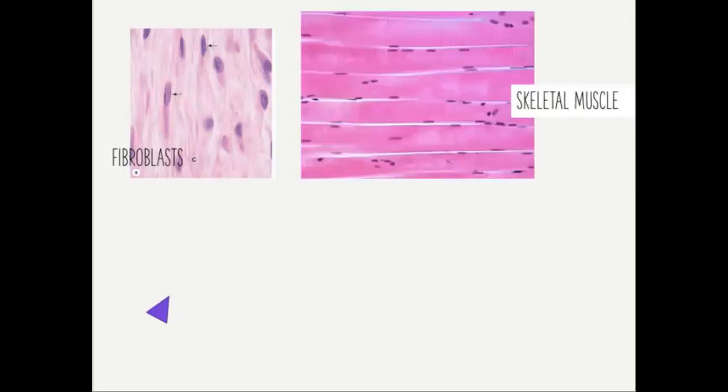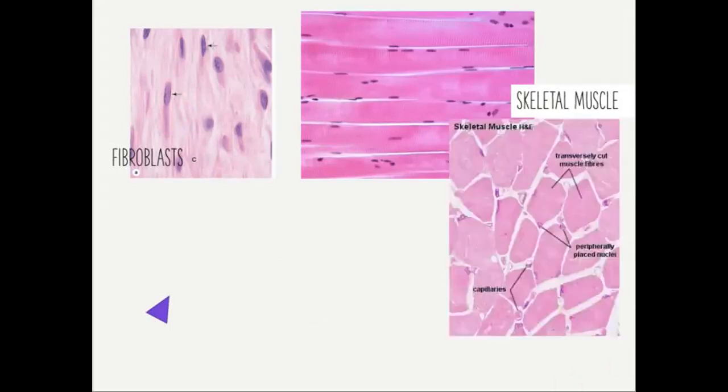This is skeletal muscle. They have long cylindrical cells with many nuclei, and these nuclei are flattened and pushed towards the periphery of the cell. Also, you have to keep in mind that we are looking at the cut sections of 3D structures. So, depending on the cut direction, the shapes can vary. See, this is the same tissue cut in a different direction, this way. It shows the cross sections of the muscle fibers.